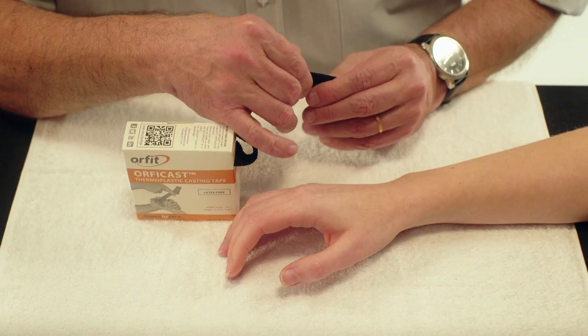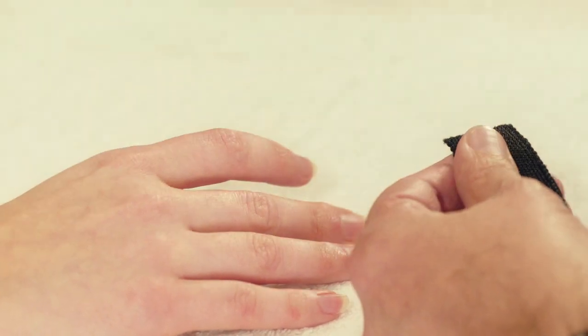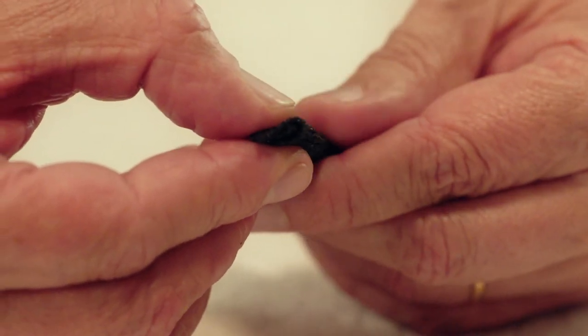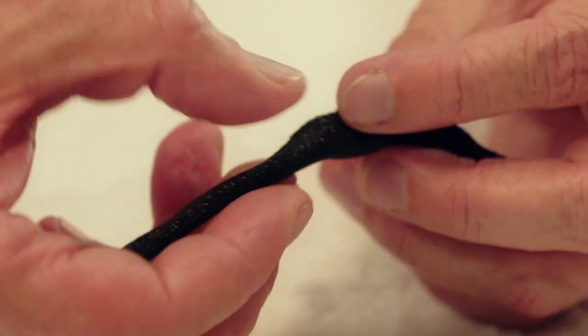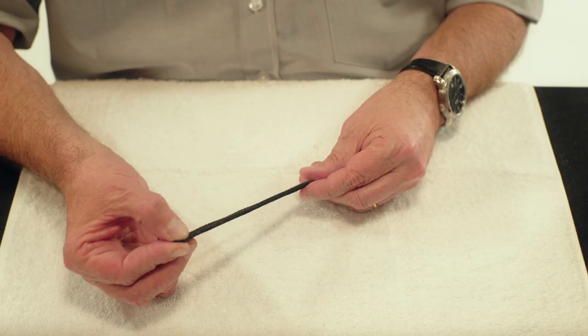Use a strip of Orphicast 3 cm wide and 10 cm long. Fold the Orphicast in thirds lengthwise. Press together and stretch a little.